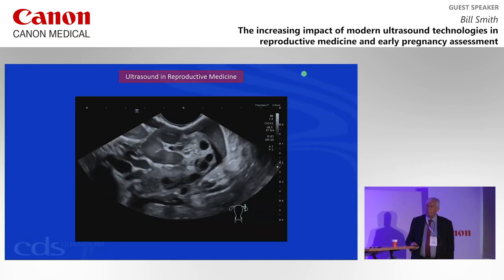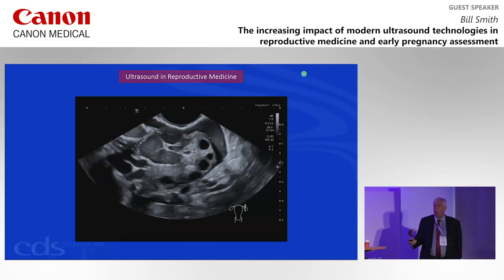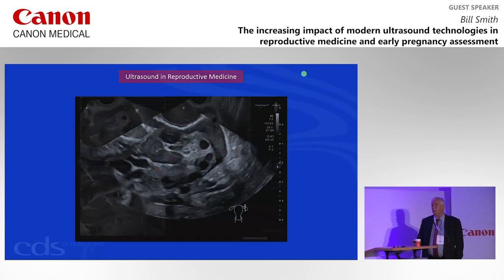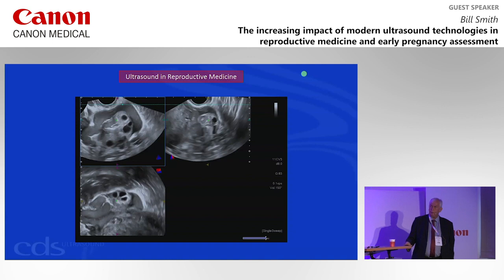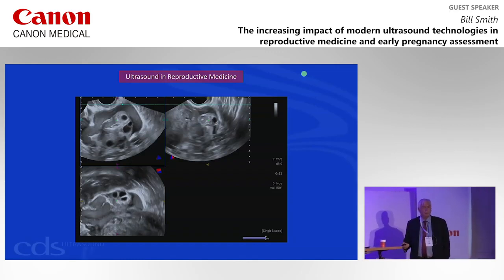And we look here, we see the follicles there. This is blood flowing through adnexal vessels. This is hemorrhage, free fluid hemorrhage, peri-ovulatory changes. So our Grayscale capability needs to produce this level of imaging. Again, as I said, this applies to 3D as well as 2D. Make sure that with your 3D imaging, the parasagittal and coronal sections are comparable in terms of both contrast resolution as well as spatial resolution.